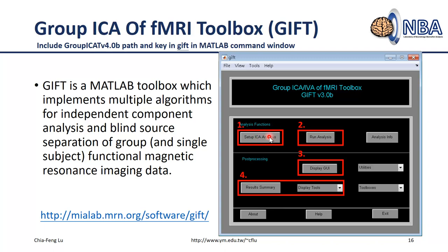After setting up all parameters, you'll have an ICA parameters file in your assigned folder. Then click 'Run Analysis' to perform all analysis steps. After running, the Display GUI will automatically pop up. If not, click the display button. You can also review previous analyses by clicking Display GUI and selecting the parameter file created in the first step.